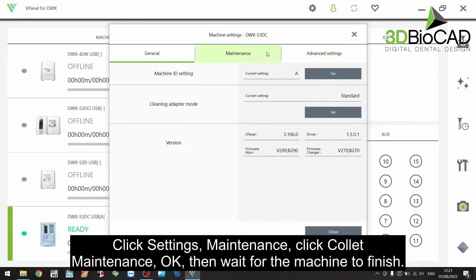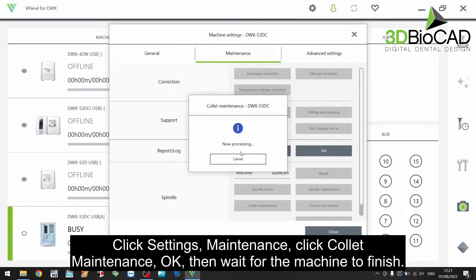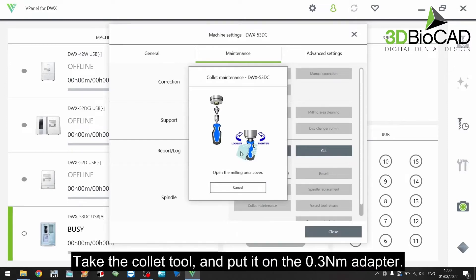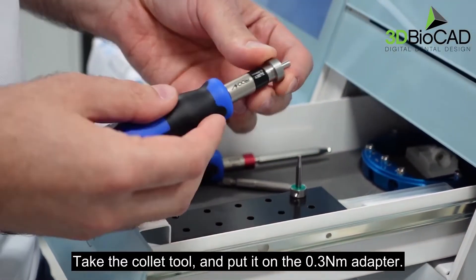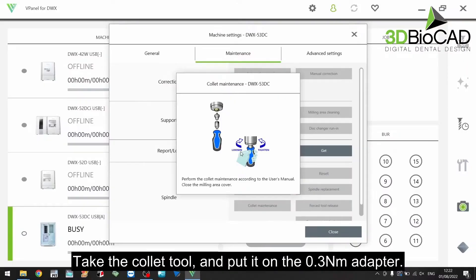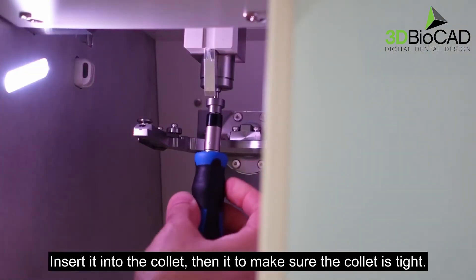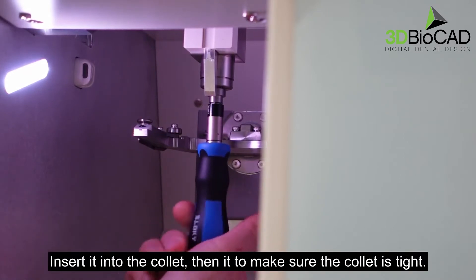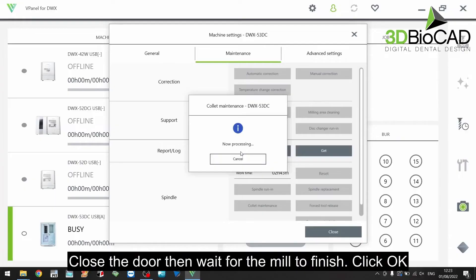Click settings, maintenance, collet maintenance. Click OK and wait for the machine to finish. Take the collet tool and put it on the 0.3 Nm adapter. Insert it into the collet and turn it to make sure the collet is tight. Close the door and wait for the mill to finish, then click OK.